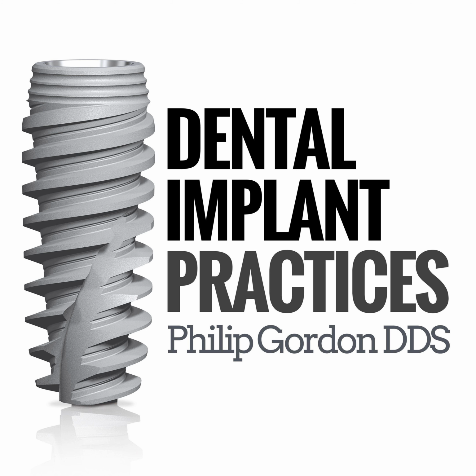So we check out the scan. We get all of our 3D models ready for our Maven Pro software, because it's all 3D. Not with 3D glasses or anything, but you can manipulate the upper and lower. We can change the bone cuts if they're needed. You can see where the sinuses are, where the nasal floor dips down. You see how the new prosthesis is going to occlude with the opposing, how much bone we're removing, where the implants are, what type of abutments are needed. Are they angled? Where are they coming out of the prosthesis?